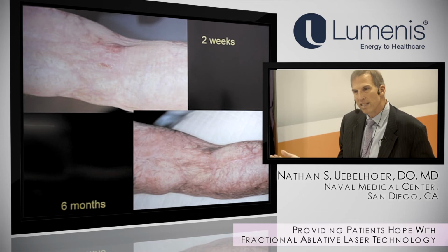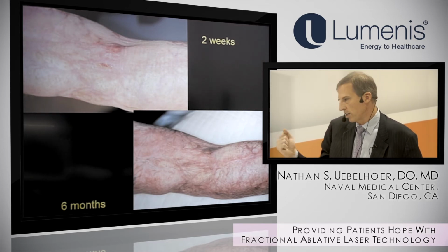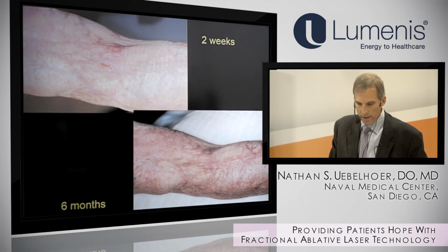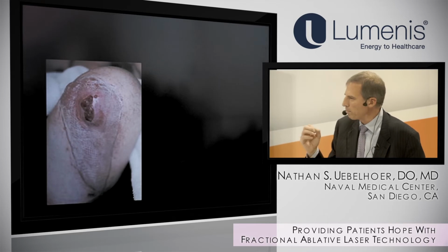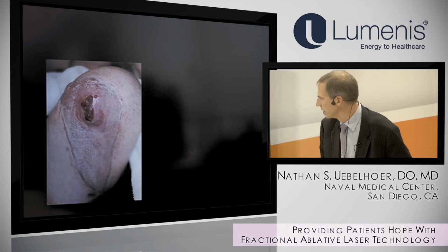We have seen in these cases that the longevity of the ulcer healing doesn't always last as long as the longevity of the functional improvement. But it is remarkable to show that that's an option. Finally, treating over these graft sites where there's a lot of pressure against prosthetics has been incredible for us as well.